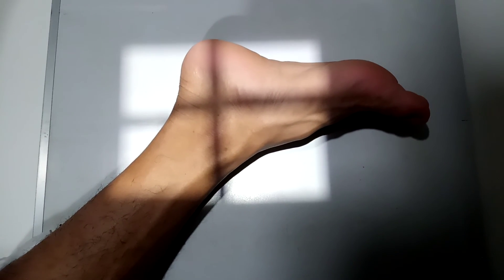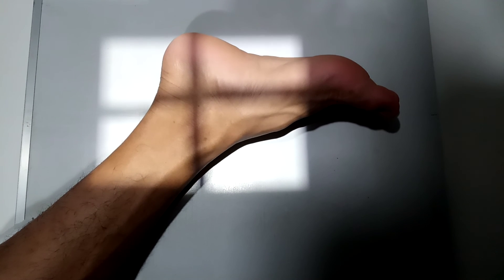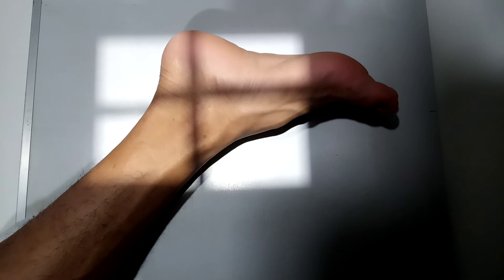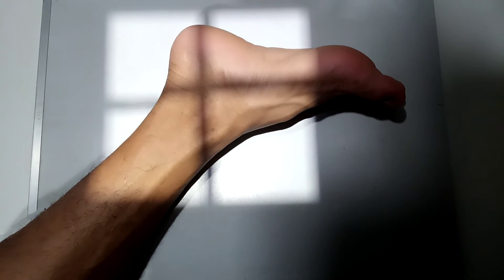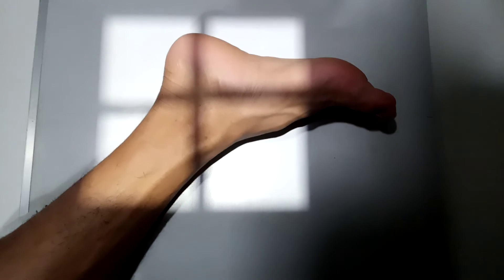The collimation again: collimate on the four sides to the ankle region, including the distal tibia, fibula, and proximal metatarsals. Collimate it. Perfect. That would be all.